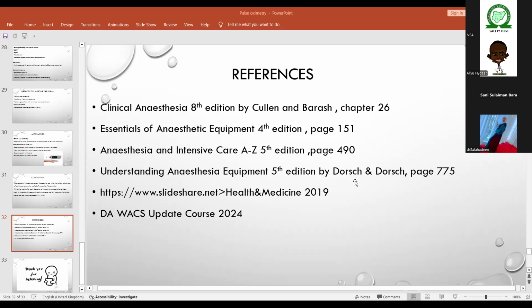But if I think of it, pulse oximetry cannot tell me the viability or evidence of life. Because evidence of life is that, okay, taking oxygen, I'm able to metabolize it out to CO2. But pulse oximeter will just tell me that okay, I have gas in me. So ideally, if I can have it, I don't know how to answer this argument. I would say ETCO2 is better.